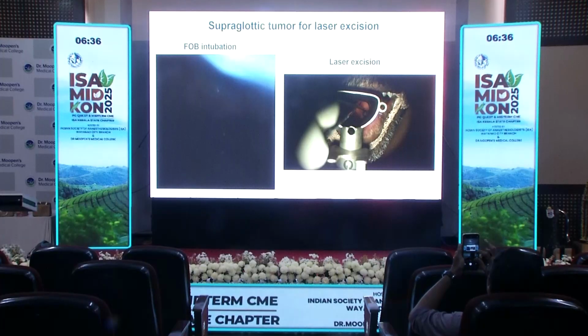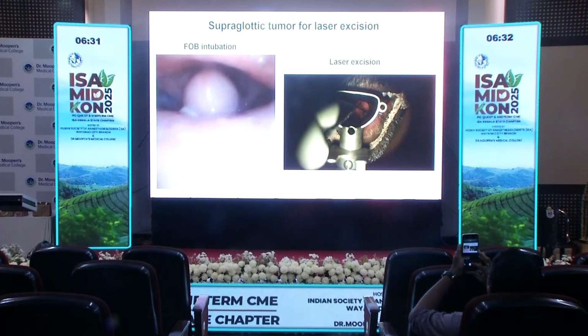So this is just two cases. This is a supraglottic tumor for a laser excision. Here the patient, the first one, the patient had a big supraglottic mass which was sitting in front of the glottic opening. We opted for a fiber optic intubation.